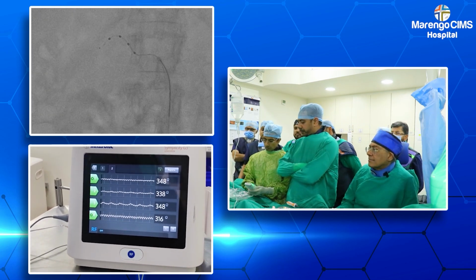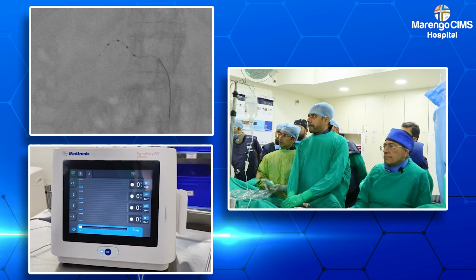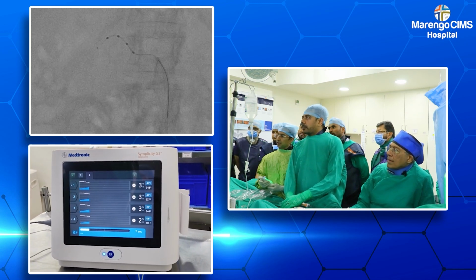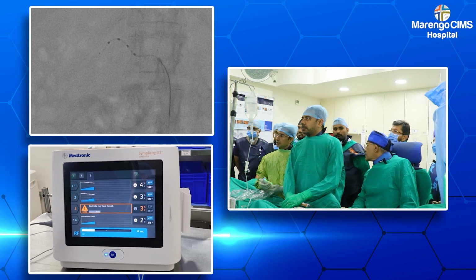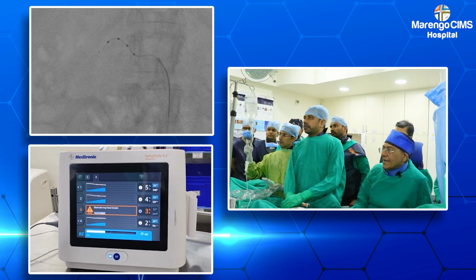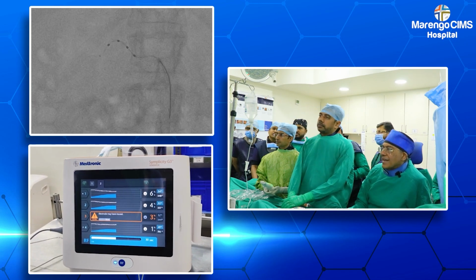Please go ahead and start. So starting the ablation, you will see on the monitor that the temperatures will slowly rise and the percentage is also depicted there, and the resistance in ohms for each electrode. So as you see, slight movement automatically shuts off the electrode. And that is the whole computerized system, as we call it, the AI.